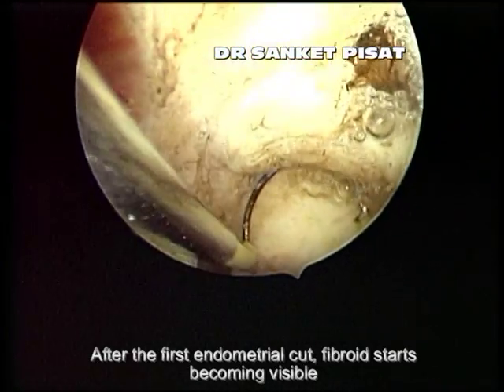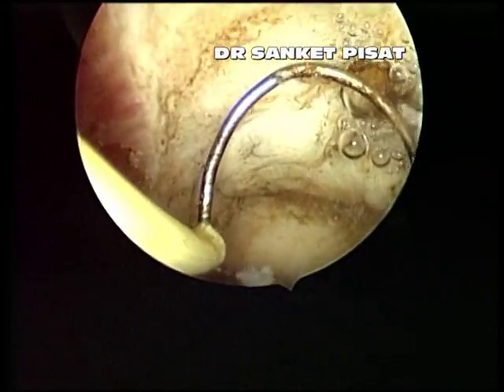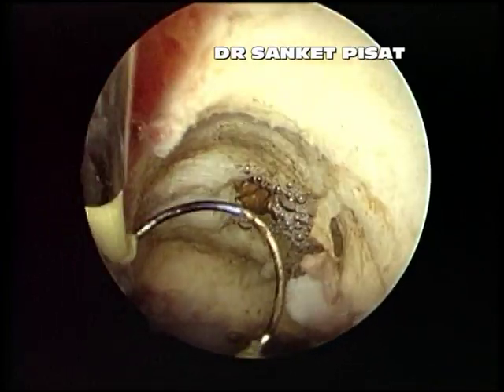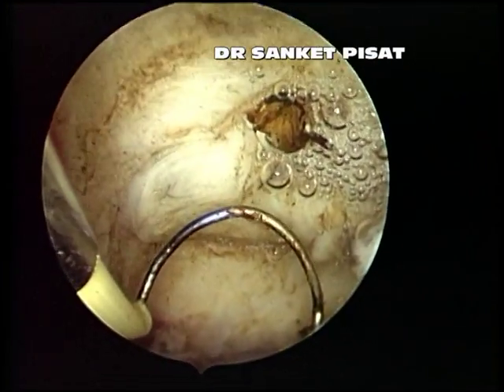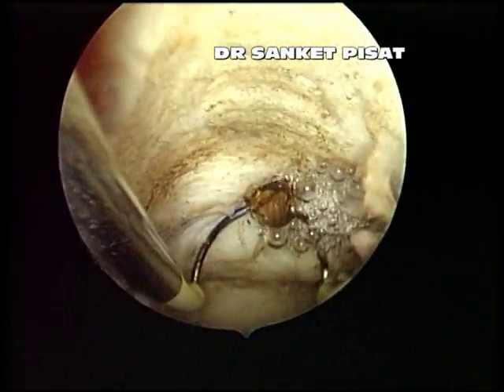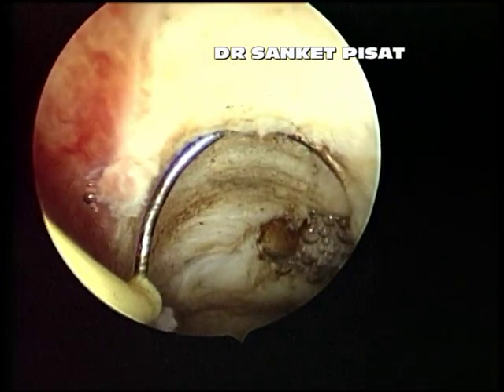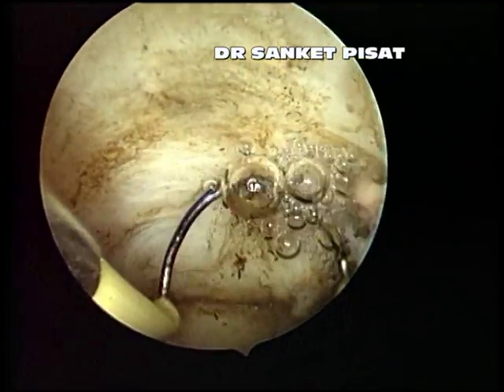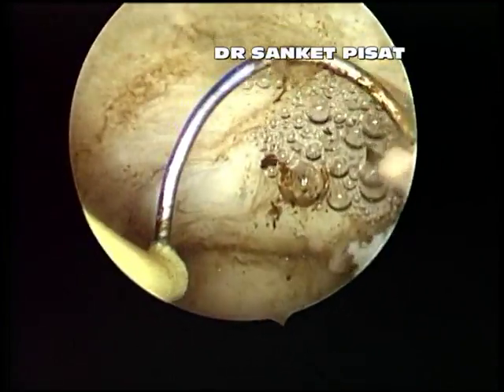Following the same principle as discussed earlier, rather than dissecting into the myometrium using a burrowing technique and increasing the risk of perforation, the extent of the fibroid is first carefully determined by the operating surgeon.